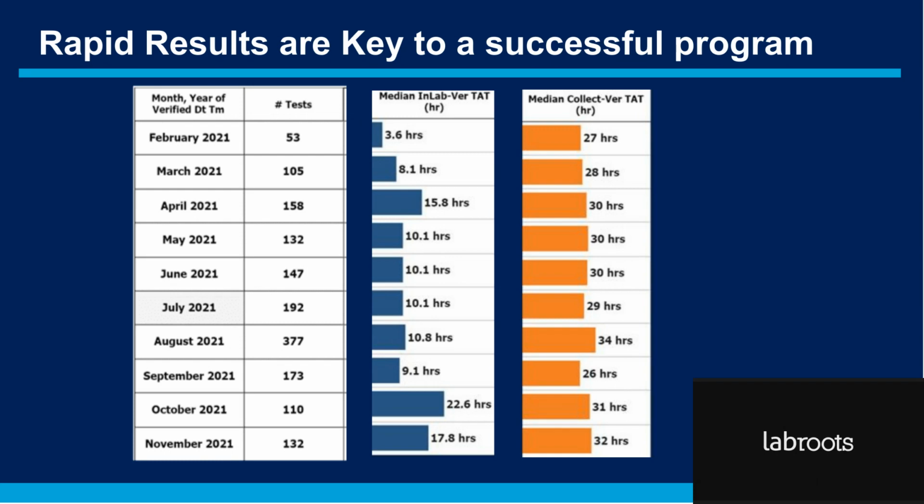At the moment, we're batching once a day, and we're not doing much testing over the weekend, but we're already thinking that we want to do a little bit better than that, and probably we'll start testing heavily on the weekend as well. And keep in mind that we're doing this in a central lab location, so there's some transportation for some of our samples coming from our hospitals.